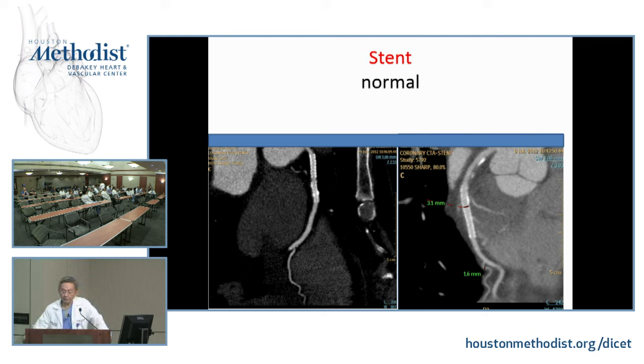Two is, conceivably, one of our fellows could do research on cases where there is so much calcification and another test was done, just to look at the accuracy of detecting ischemia or stenosis. I think that's important because I agree with Muaz. At some point, we have to say, this may not be the most appropriate test because we have so many other tests we could do on a particular patient. Correct. And stop and say, we probably should do either a PET or a stress test or something else to tell us about disease.